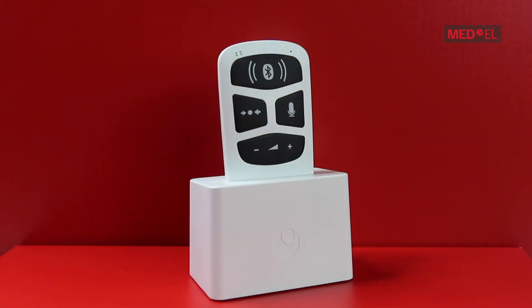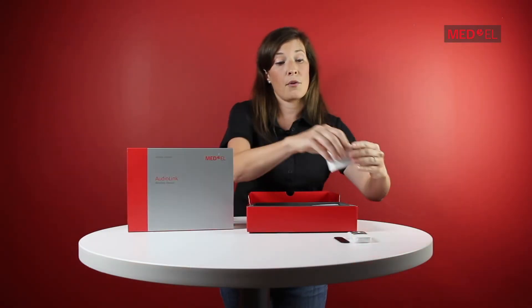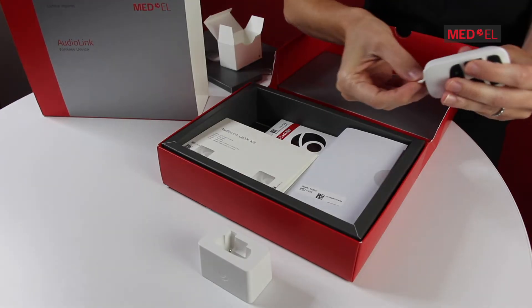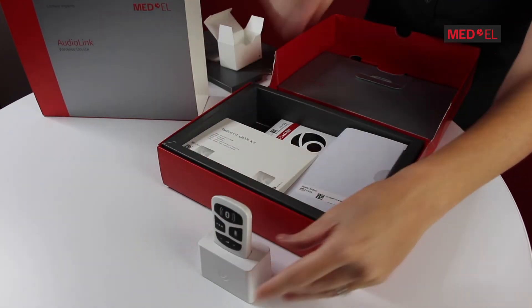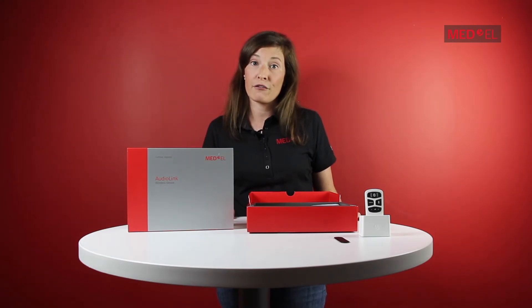Also included in your kit is the cool docking station. This can be used for streaming from television, or it can be set up on the table for the remote mic function like so. And bonus — your AudioLink also charges while it's sitting in the docking station. Remember, you will need to fully charge your device before you use it for the first time.